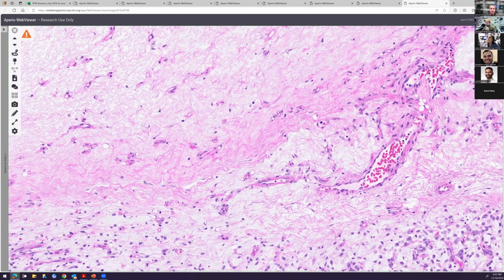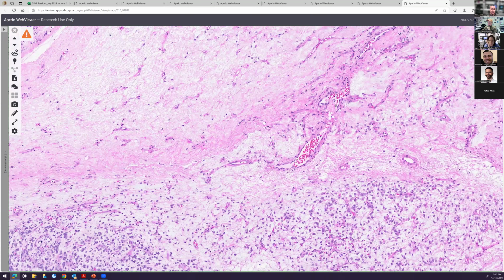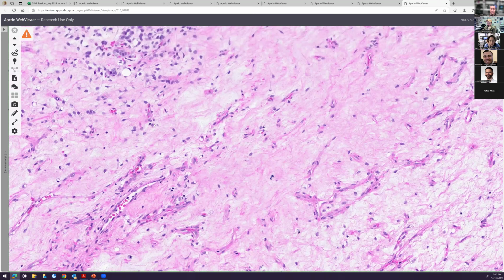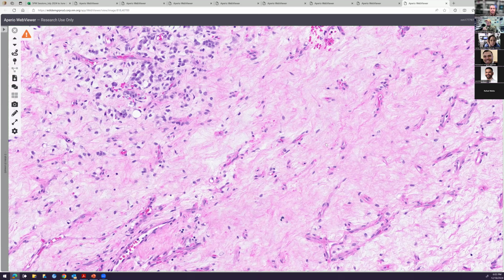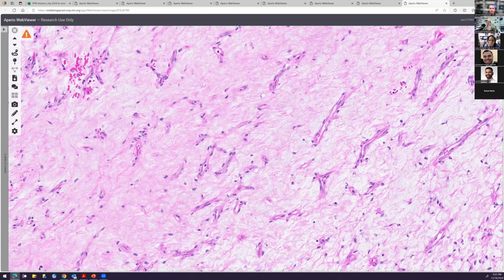What's your criteria to diagnose high-grade myxoid liposarcoma? I want to see a round cell component, meaning a small round blue cell tumor. Yeah, exactly. Basically, the nuclei need to have a high nuclear density. So you'll have conventional areas of myxoid liposarcoma, and then an area with high density, where the nuclei are almost touching. Now, there's not exactly a percentage cutoff. People say like 5%, but if you see any solid nodular focus like that, I would call that high grade. Cool.